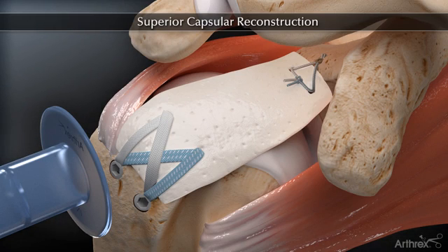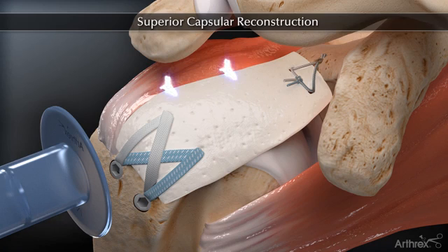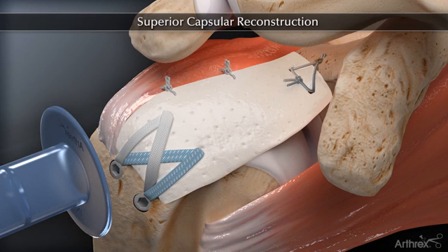Margin convergent sutures are added posteriorly between the ArthroFlex and remaining rotator cuff tissue. Anterior sutures can be added, but care should be taken not to over-constrain the interval. The completed superior capsule reconstruction helps reduce superior humeral translation and improve shoulder kinematics by anatomically replacing the superior capsule.